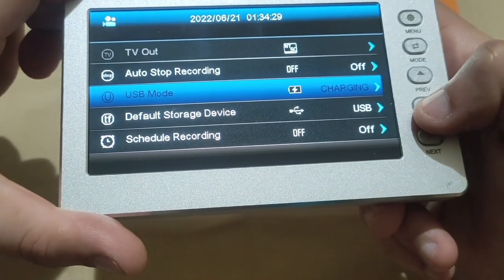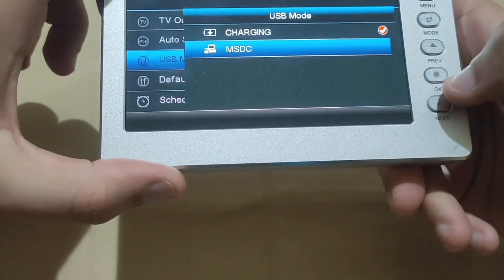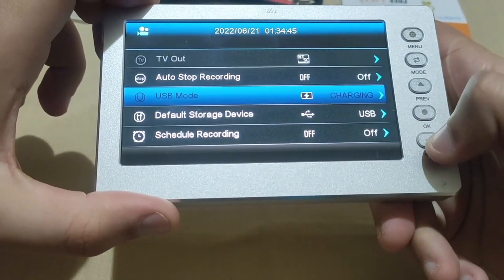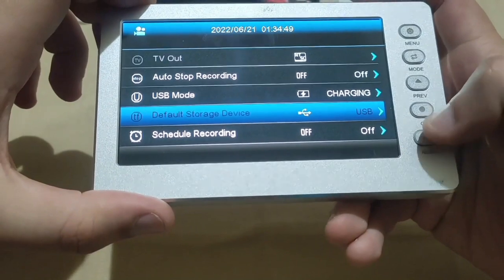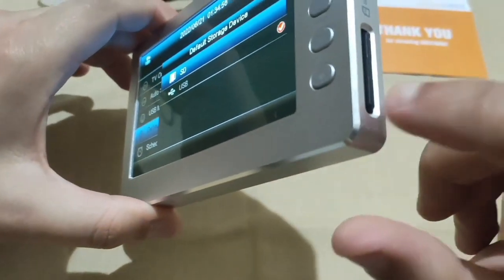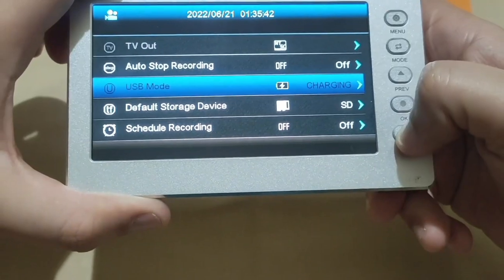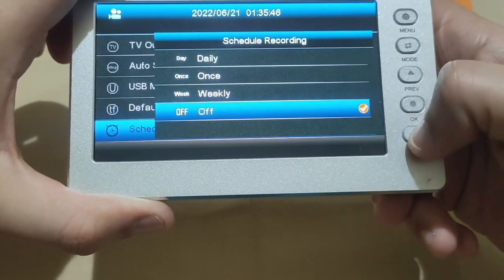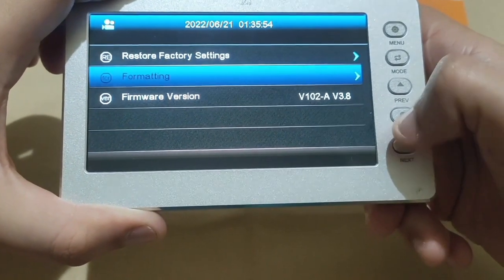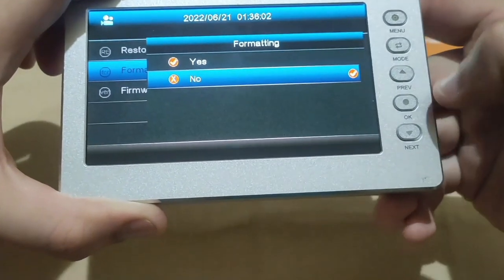Now, the USB mode can be changed for charging the battery or for Mass Storage Device Class, MSDC. To change the storage device, go to default storage device and choose between the SD card and USB drive. Schedule recording. This option allows you to set time and date of timing recording. Now formatting is used to format the storage device, either the SD card or the USB drive.